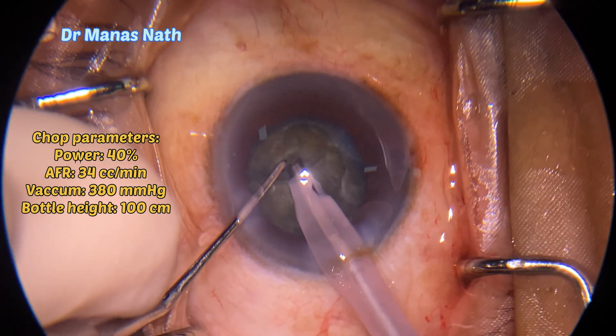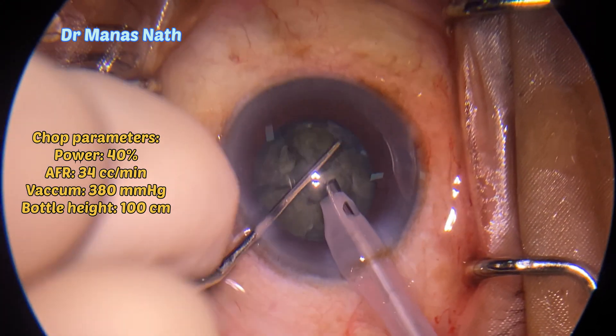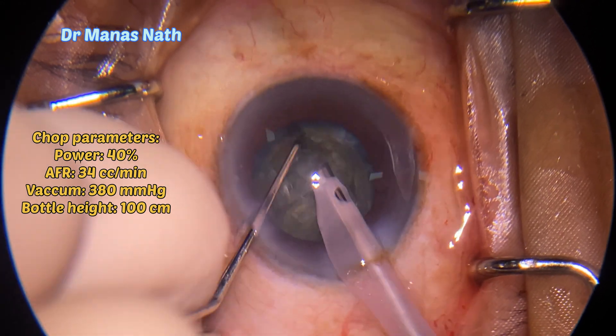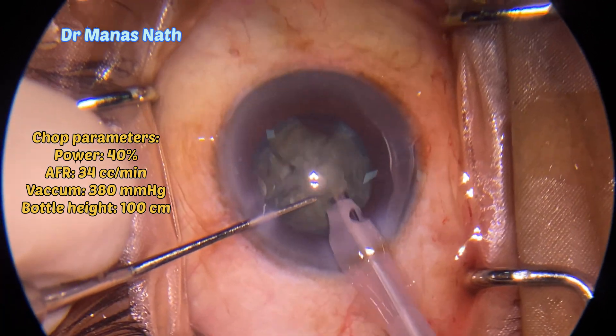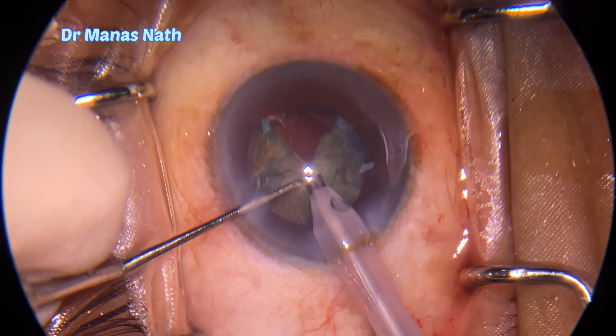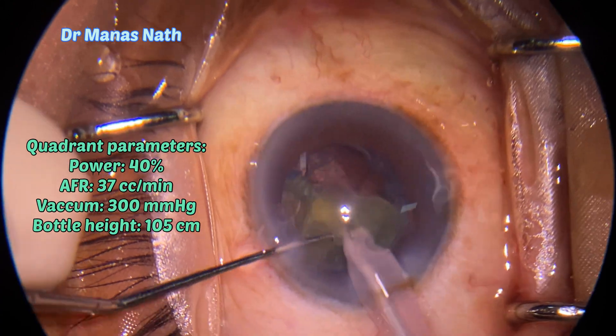Chop completed here. That's the last chop and now I've started taking out each pie, doing quadrant emulsification. I have changed my chopper to a blunt instrument.